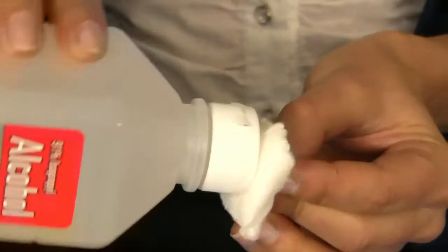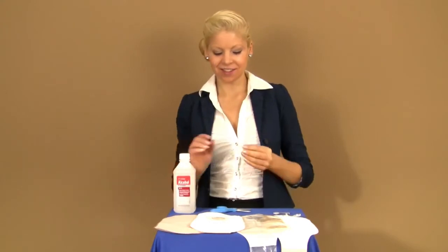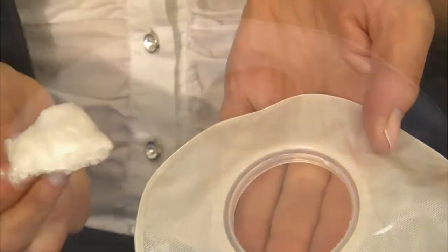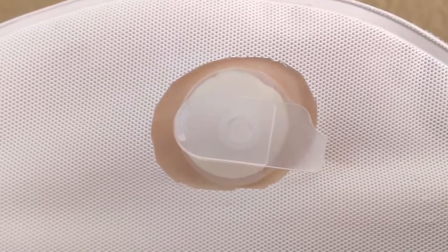Soak the white cotton pad with the isopropyl alcohol. Clean the area at the top of your pouch until the shine is dulled or removed. If your pouch has a cover, cut a hole at the top to access the pouch material below.